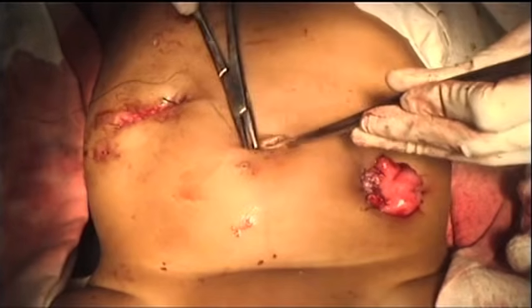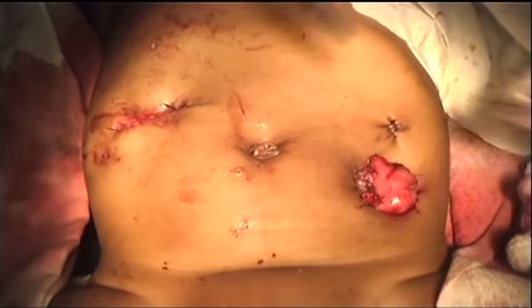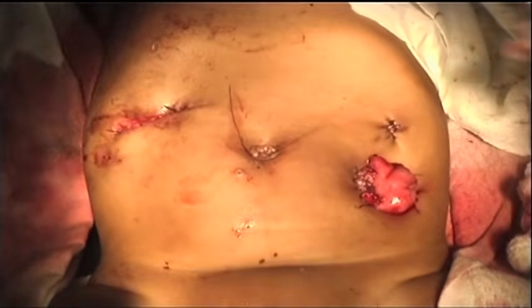Finally, a couple of stitches to close the umbilical port, and that brings us to the end of the operation.